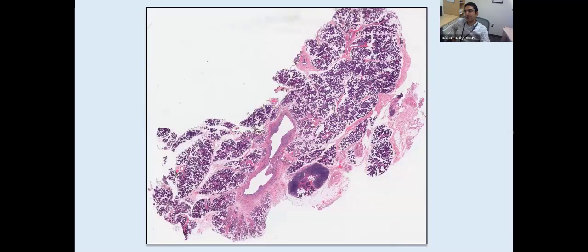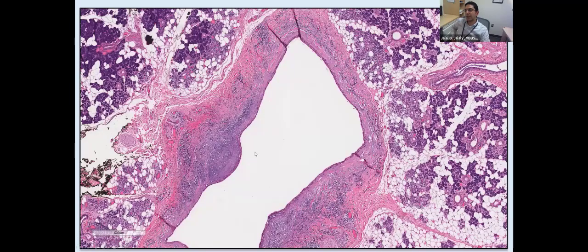And here you can see the follow-up surgical pathology specimen that shows a dilated cystic lesion here in the middle of the parotid. You can see here that there's a periparotid lymph node that does not look abnormal. And this cystic lesion is associated with these ducts. Looking closer at this lesion, you can see here that it is definitely inflamed.